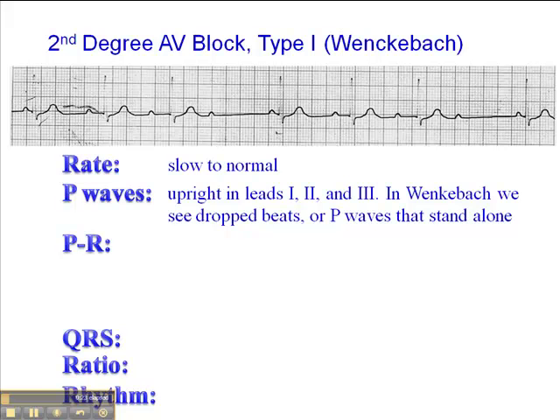In Wenckebach, what we see are dropped beats, or P-waves that stand alone. For example, we see a P-wave with a QRS, P-wave with a QRS, P-wave with a QRS, and here we have a P-wave that stands alone. There's no QRS following it, then another P-wave and QRS, and so on and so forth.